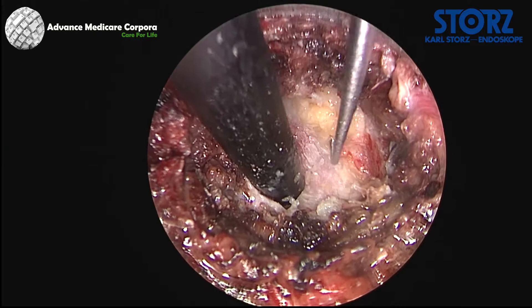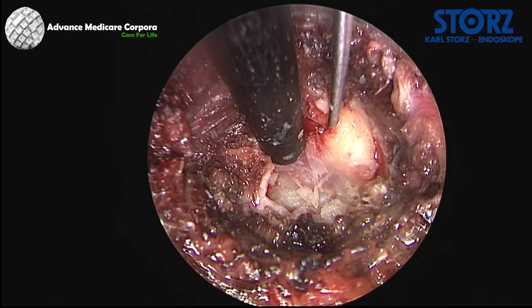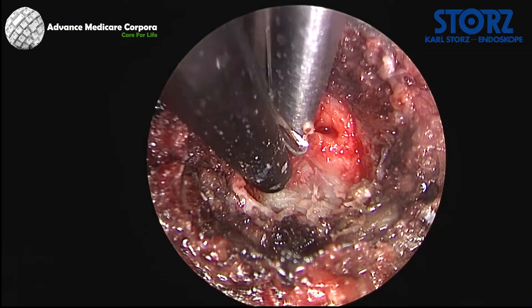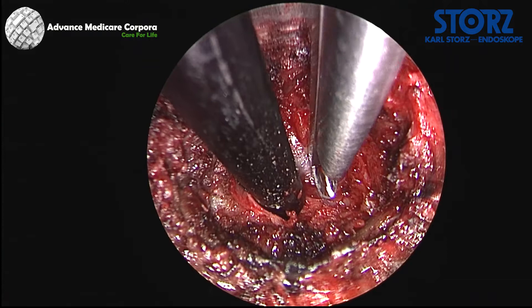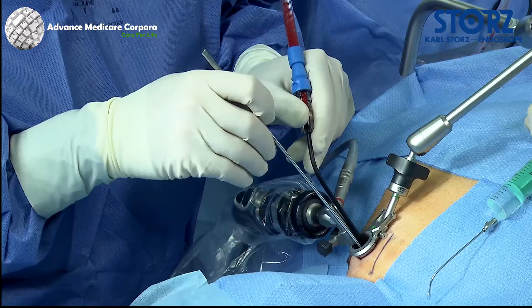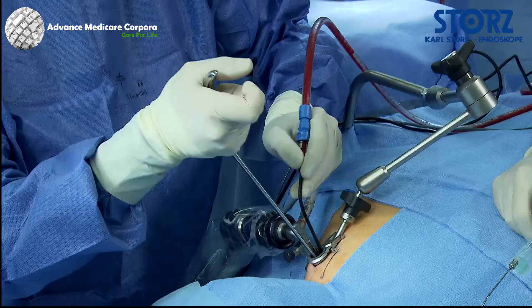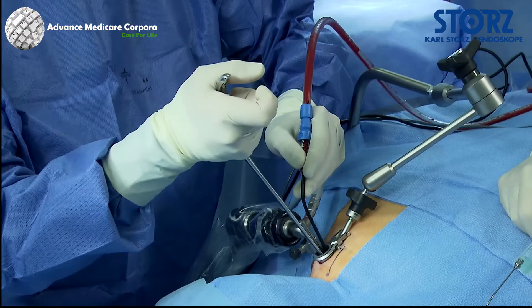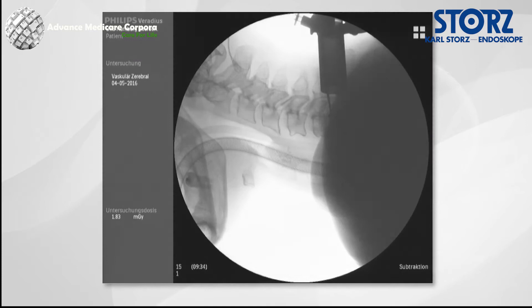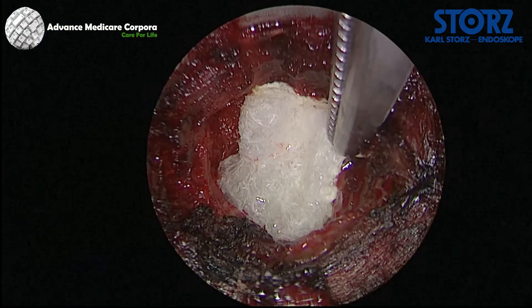The palpation probe is used to incise the ligamentum flavum and the lateral dural wall is identified. This is followed by lateral resection of the ligamentum flavum until the exit of the nerve root can be identified. The nerve root is then gradually decompressed laterally using the diamond drill and the Kerrison punch. Towards the end of the decompression, the correct height should be verified with a lateral x-ray.